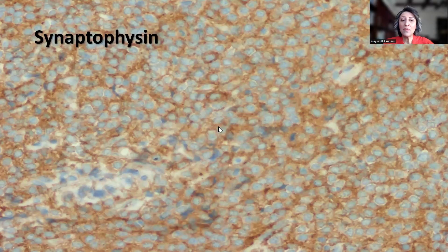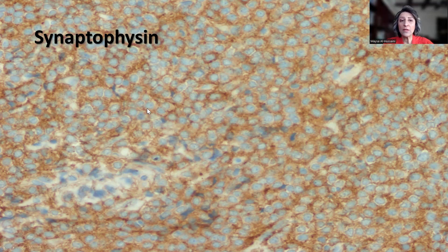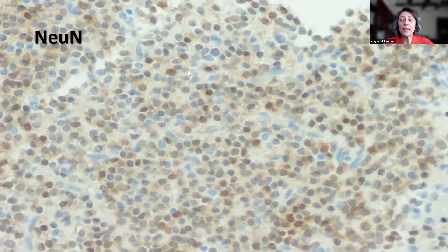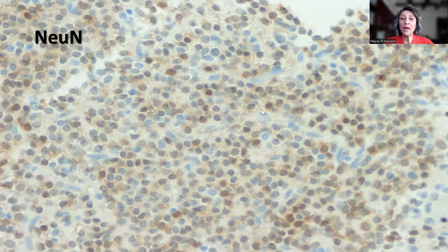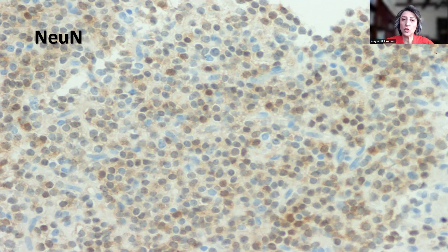Synaptophysin, on the other hand, appears to be positive, and it's not only in the background — the tumor cells themselves show cytoplasmic positivity in the cytoplasm, and this is how we interpret synaptophysin. NeuN is a nuclear stain for a neuronal marker, and in a neurocytoma it tends to show focal variable nuclear staining. I would not expect NeuN to be strongly positive; it's not usually strongly positive.